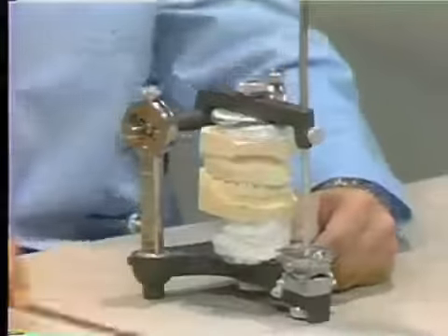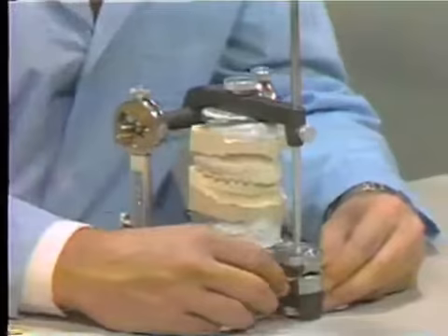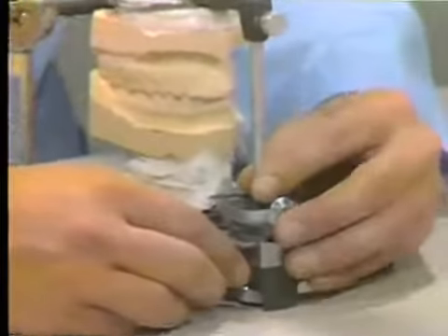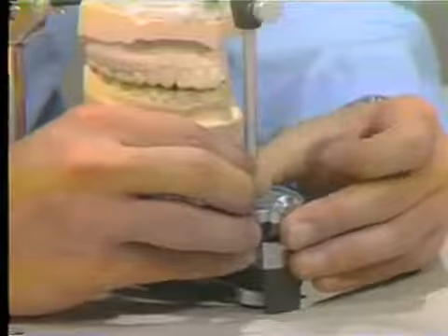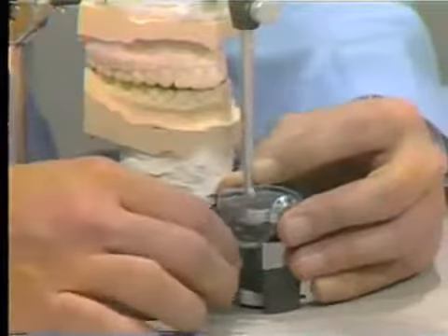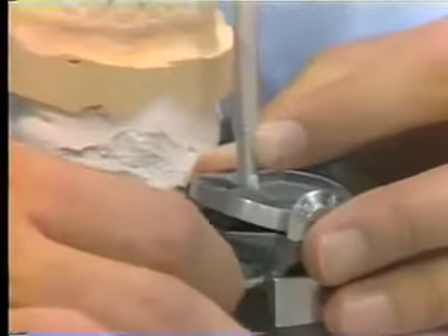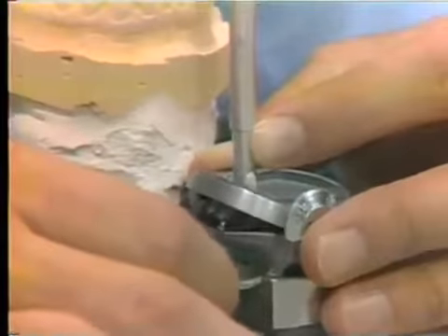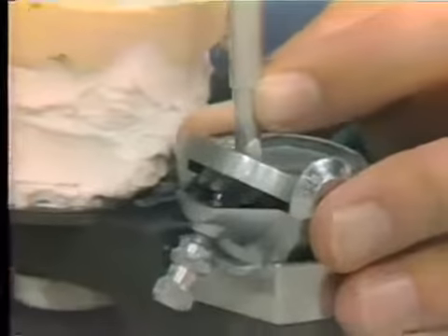Now, as I mentioned earlier, in almost 99% of the cases, we can raise the lateral wings of the incisal guide table to simulate the lateral excursion. If I move the upper member of the articulator to the right, it does not necessarily mean that the anterior teeth have to provide the guidance. It can be coming from the posterior teeth, but the guidance is necessarily coming from the stone cast. I can raise this incisal table to touch the incisal pin when the casts are in their end-to-end relationship.